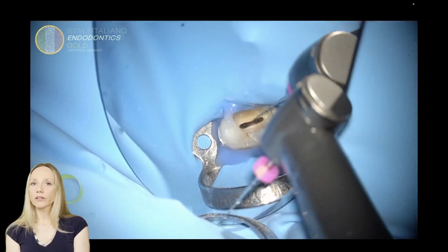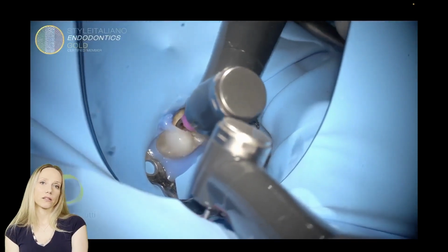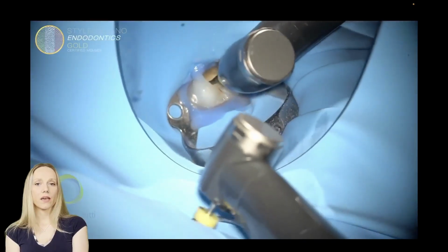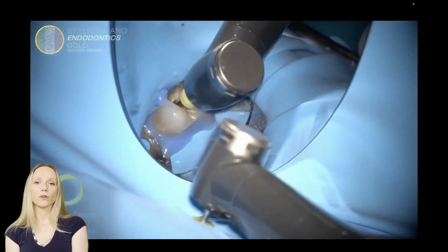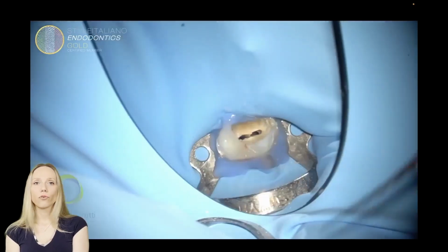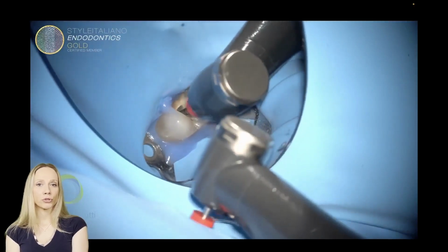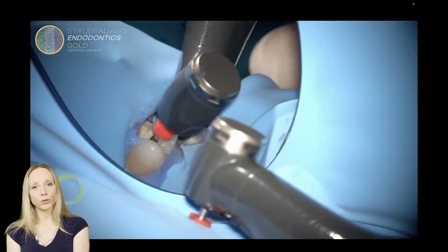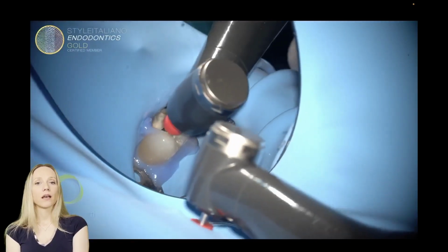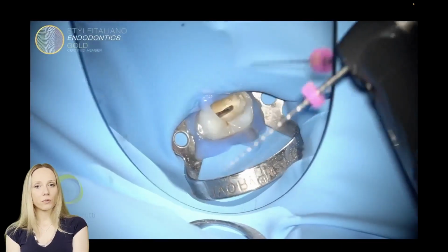I did some pre-flaring, so I worked short of working length with the first 3 files of my essential kit sequence. Then I recorded the working length, and then I go straight to working length with number 13, with number 20. I do, you see, 4 or 5 strokes, and then I rinse and I change my file. 1, 2, 3. I use a picking motion, maybe some brushing, but the main motion is picking. I arrive at my working length, good. If not, I work again with the file.